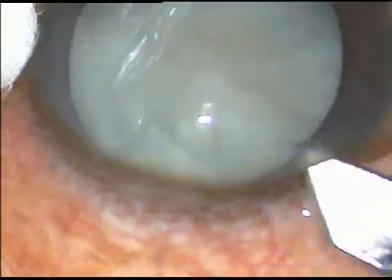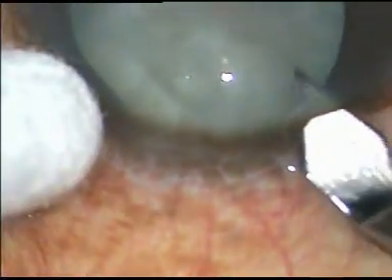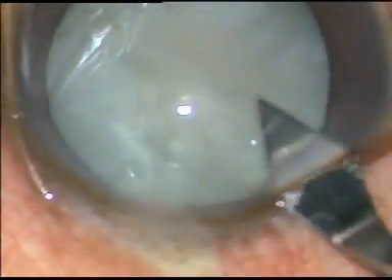Dear friends, this is an unedited phacoemulsification of an intumescent cataract.